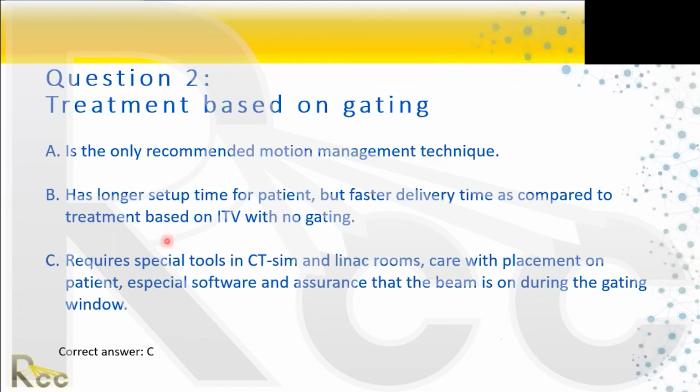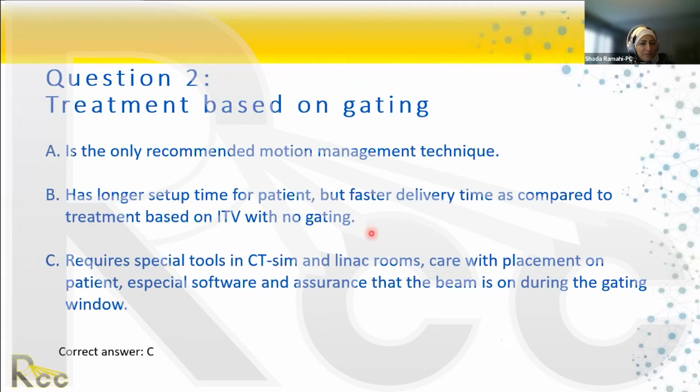It has a longer setup time, but faster delivery. Absolutely not. Gating has also the longest delivery time on the Linac, so you have to put a lot of Linac time. And it requires special tools in the CT SIM and Linac room. That is correct. Whatever you're using for the patient in the CT SIM room, you have to use it also for the Linac room.